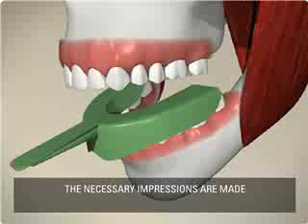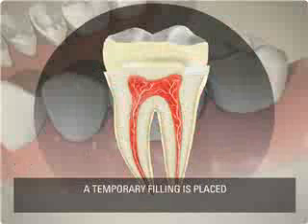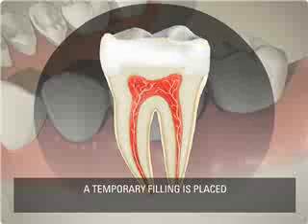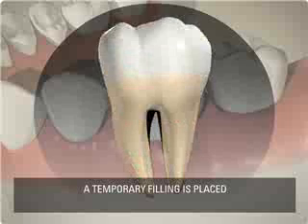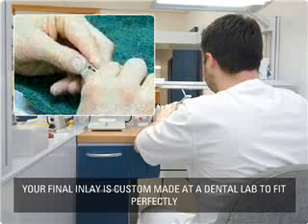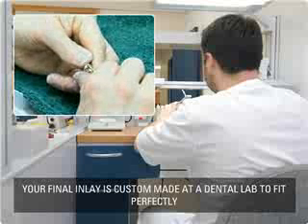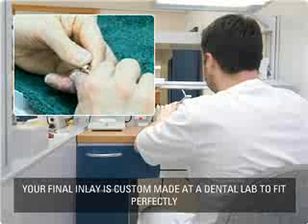Impressions are taken to model the exact shape required for the inlay. A temporary filling is placed until the final inlay is ready. The inlay is custom made at the dental lab. Your dentist will tell you how long this takes and schedule a time to complete the inlay restoration.